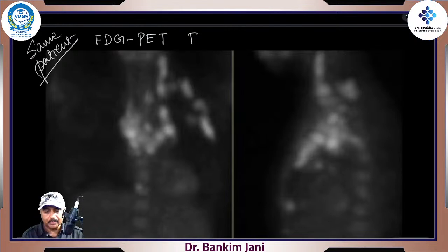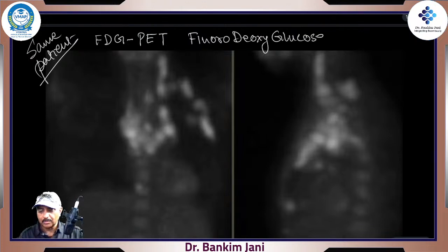I'll write it down. This is fluorodeoxyglucose positron emission tomography.